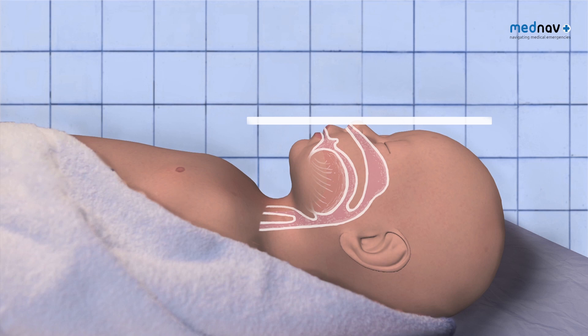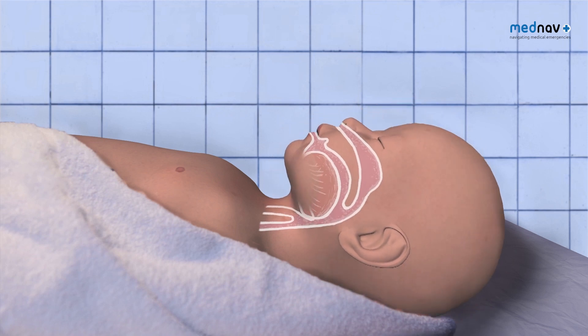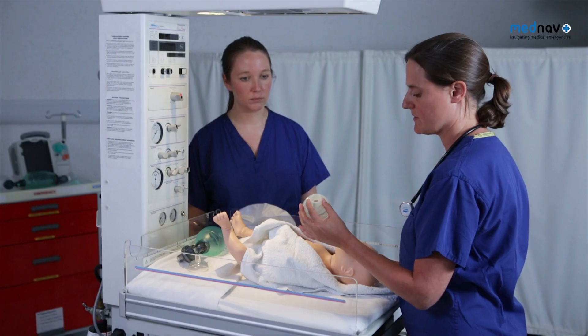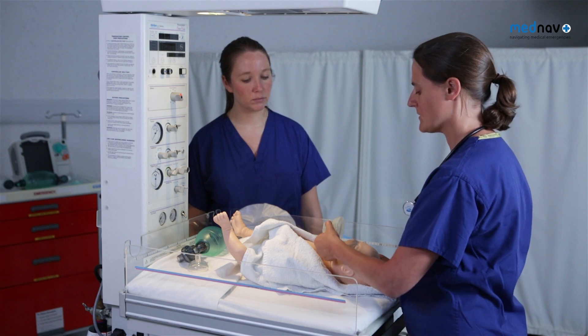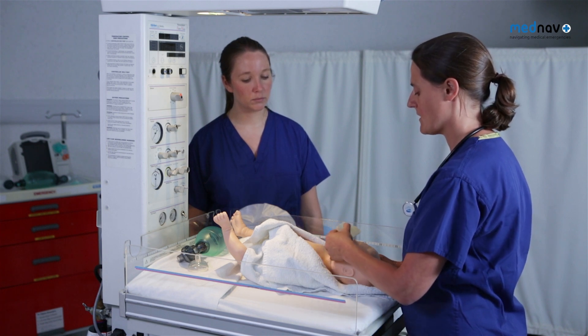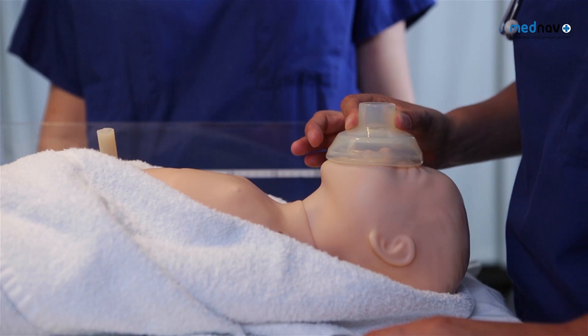Ensure the head is in a neutral position. If the head is extended or flexed, the airway will close. Hold the mask using a pincer grip. Size the mask by rolling it over the chin and the nose. If the mask covers the eyes, then it is too big.